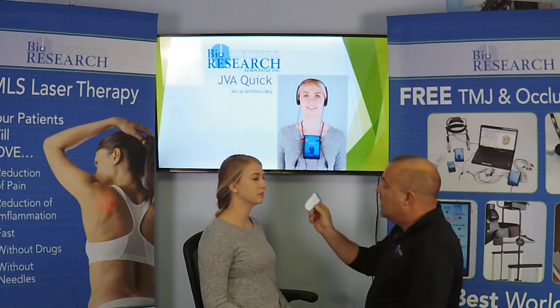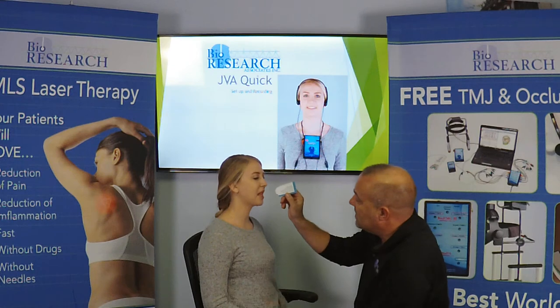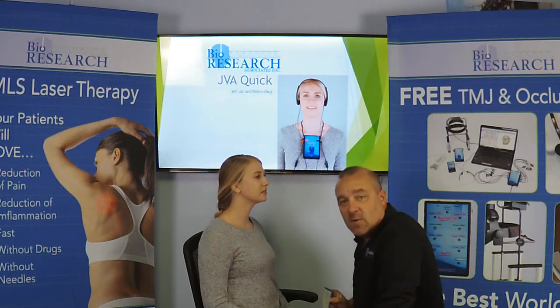To record joint vibration analysis, we click on the JVA Quick preset. Now the first thing that happens is we're asked, what is the patient's maximum opening distance? To do that, you can use a Bowley gauge, but we have these range of motion cards that are available by calling BioRESEARCH and ordering them. You simply put the notch in the lower teeth of the patient, have them open as wide as they can, wide, wide, wide. There we go, 62 is her maximum opening.